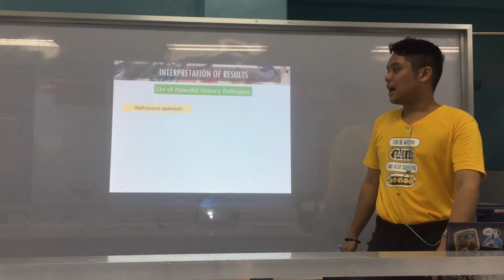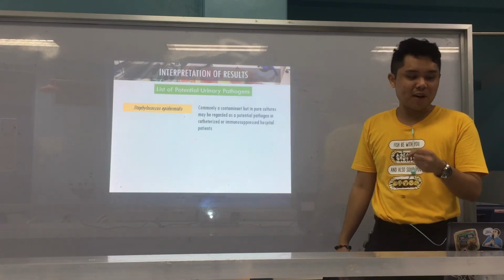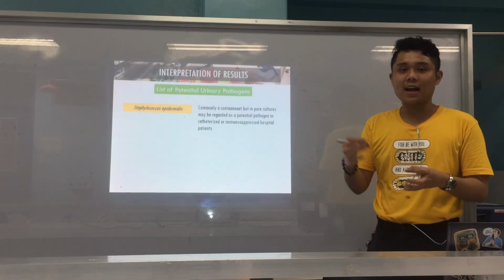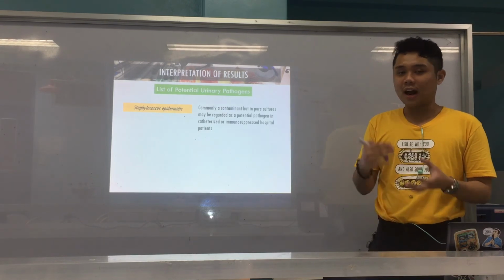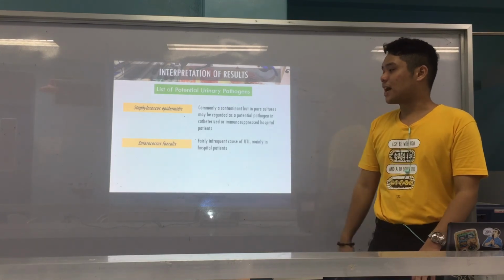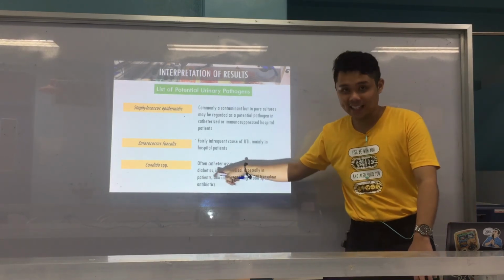Okay. All right. Next, you have Staph epidermidis, maybe a contaminant, but also maybe a potential pathogen if the patient is immunosuppressed or catheterized. Because again, maybe during catheterization, normal skin flora got introduced. So that could be Staph epidermidis, right? Okay, you have Enterococcus faecalis, an infrequent cause of UTI but still mainly in hospital patients. And Candida species, catheter-associated, diabetics, right?